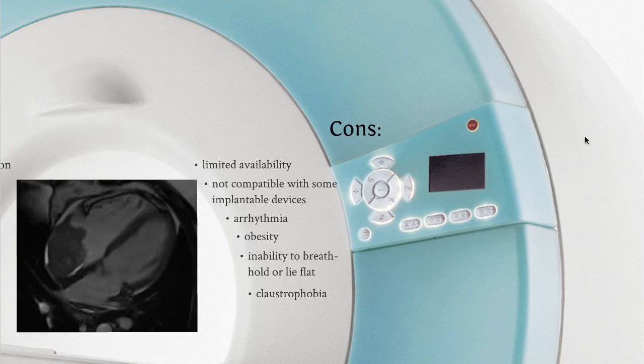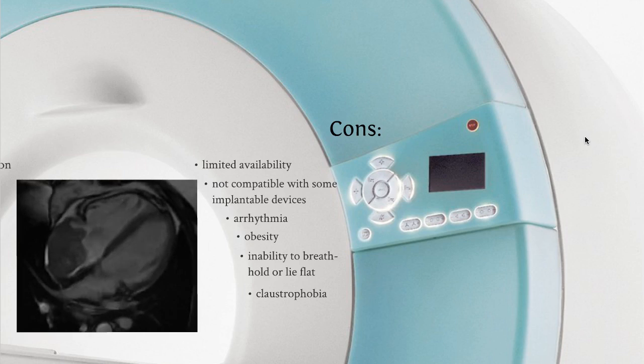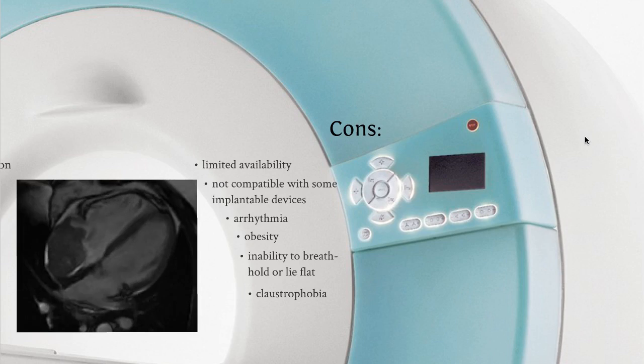We talked about claustrophobia. For patients that are claustrophobic, we do have a larger bore magnet, and when they fail on the small bore because of claustrophobia, the techs usually can get them to tolerate the large bore magnet. Open MRIs would not give you adequate spatial resolution, so nobody does cardiac MRI with an open magnet. That's really only for musculoskeletal MRI.